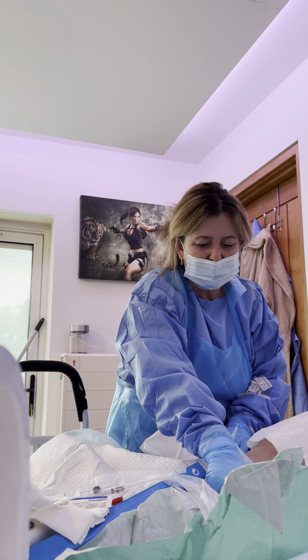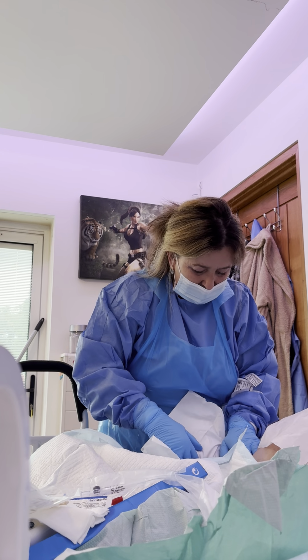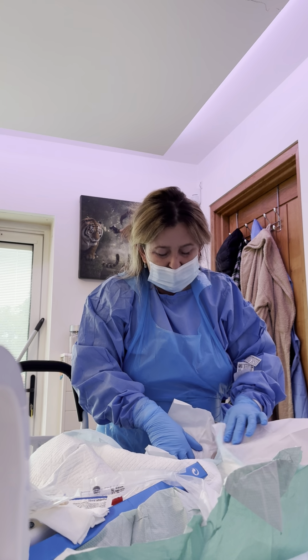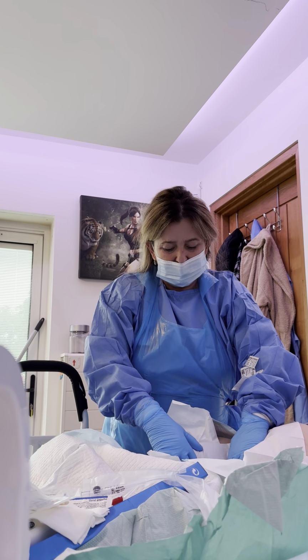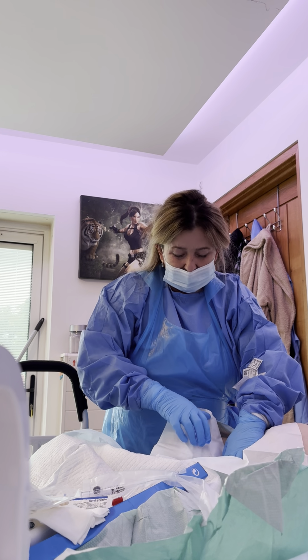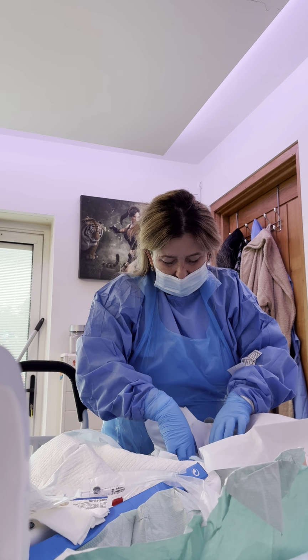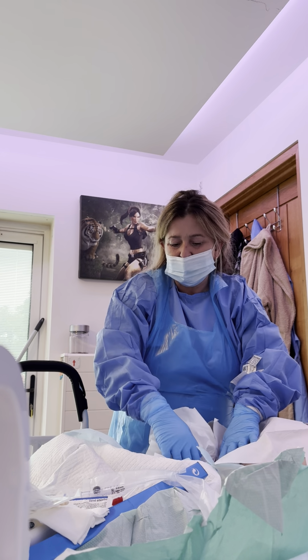So I have my new 10ml syringe, and I've got the catheter ready. I'm just making sure that I've got all the urine retention out, and I've got pads everywhere, all over him. No blood, which is nice, and that's peachy perfect.